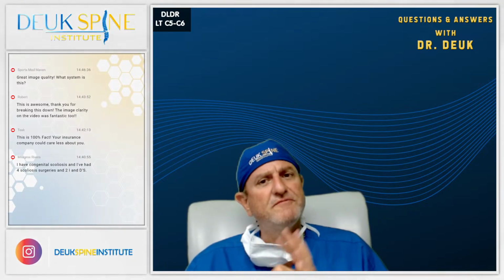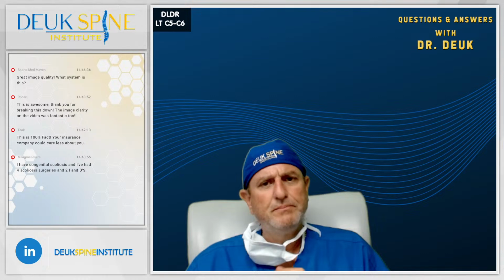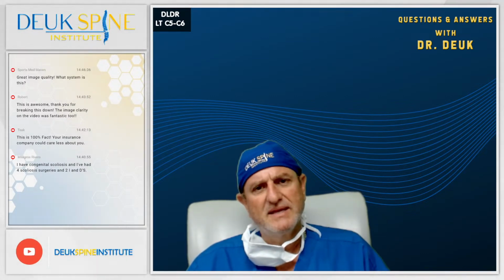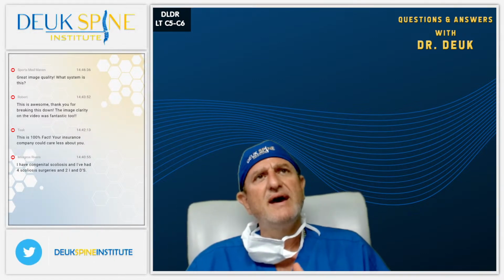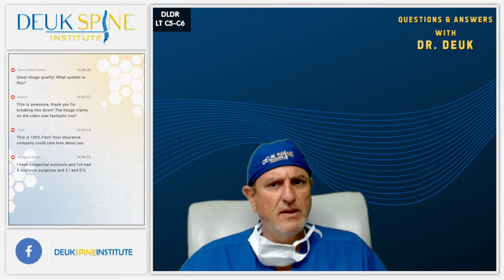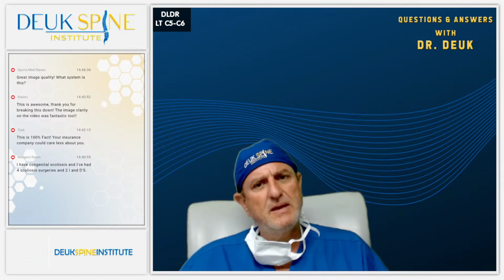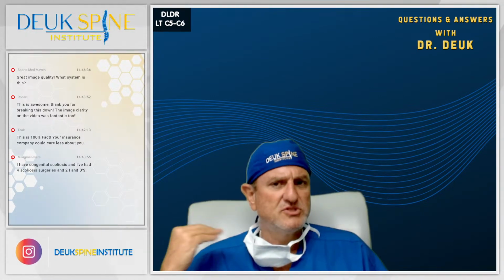It may be coming from the facet joints, which is the other cause of neck pain that's very common. If you look at our original publication in PubMed, the Deuk laser disc repair is a safe and effective treatment for symptomatic cervical disc disease. That's the title in PubMed. You'll see that 25% of our patients that had the laser on the disc also had facet pain, and we had to treat their facet pain. And unfortunately for some patients, they perceive the facet pain to be, oh, my disc pain never went away. But actually it's a different problem. It's their facet joint.